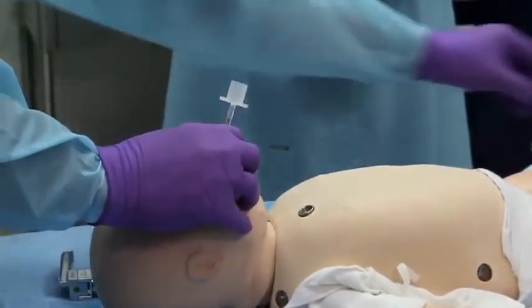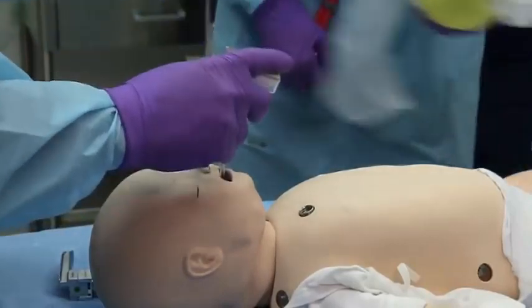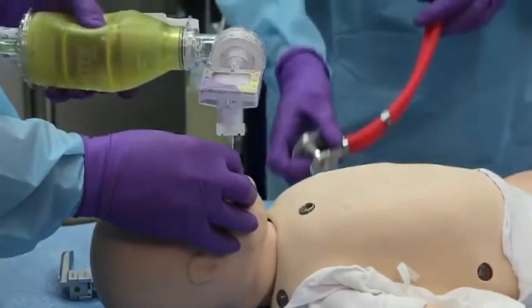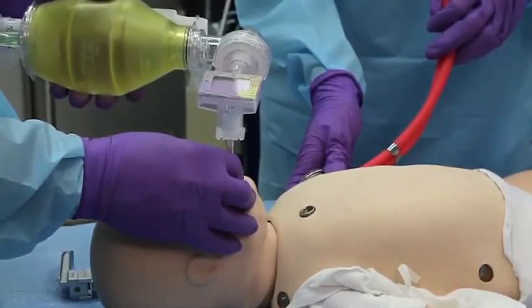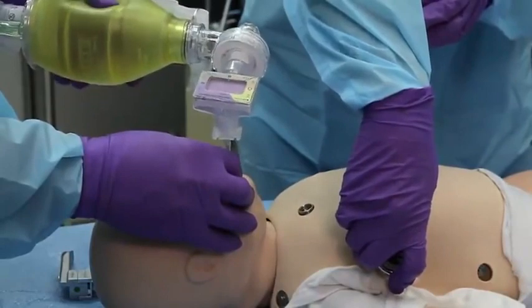Attach a CO2 detector to the secured endotracheal tube between the adapter and the ventilating device to confirm the position of the endotracheal tube in the trachea. Carefully check placement of the tube by applying bag mask to tube ventilation, observing lung inflations, and auscultating the chest and abdomen with a stethoscope.